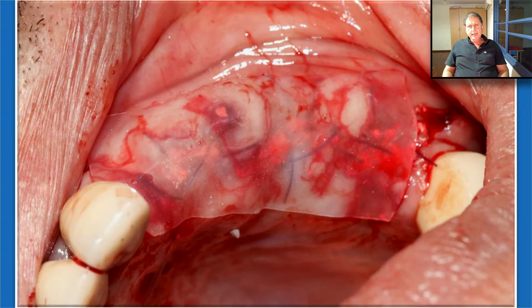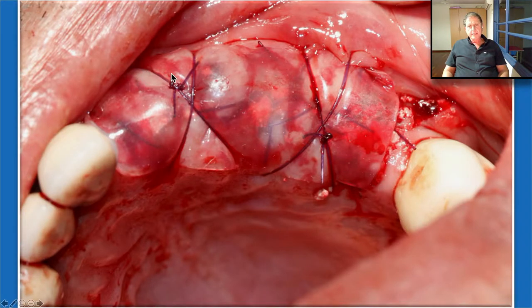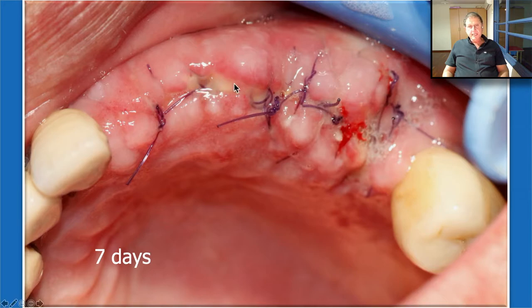We stretch the soft tissue, suture it nicely, and protect it with the Oraid — it's very easy and nice to work with because it sticks immediately to the soft tissue. Then of course we secure it by suture: we go from one side to the other, and two sutures like that are sufficient for such a large area. We know the Oraid band will never fall down. Already seven days post-op, everything was breached by new soft tissue that proliferated into the area. We don't need to be afraid because Bond Apatite from biphasic calcium sulfate is bacteriostatic, so exposure never leads to contamination.